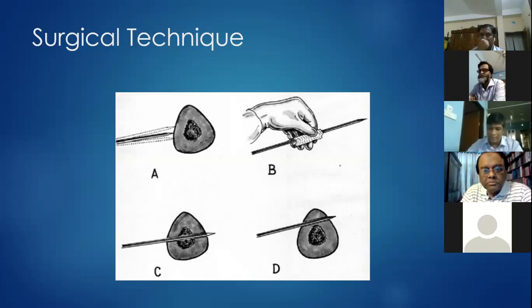Ideally, the wire is drilled through both sides of the cortex, passing through the bone canal and bone marrow. Transmedullary wire insertion rather than cortical insertion is important because it provides greater wire stability and helps prevent cortical osteomyelitis. When the second side of the cortex has been penetrated, drilling is terminated.